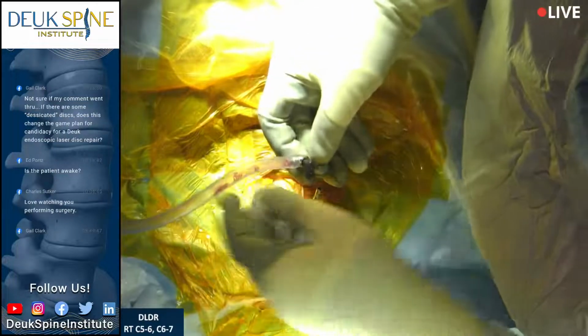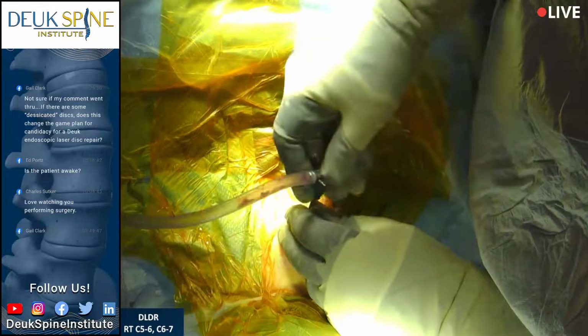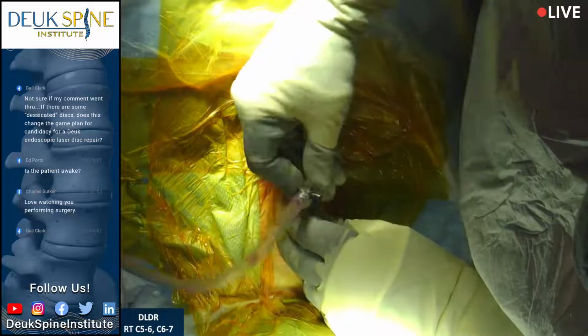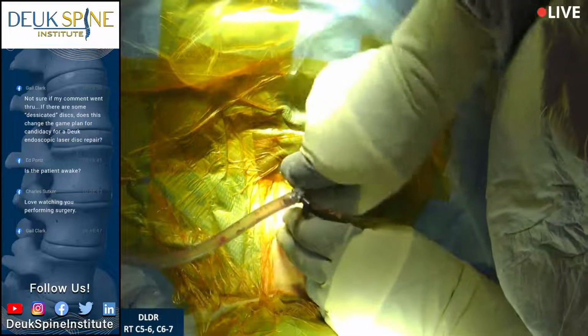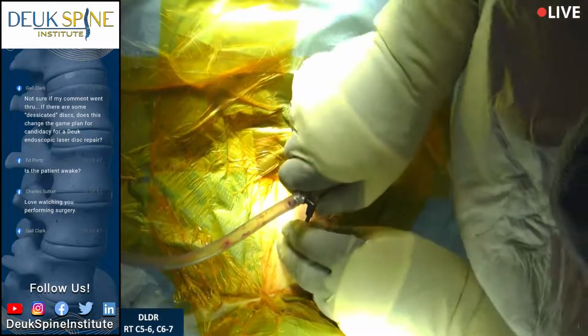But you have to get more of these tubes, Luis. How many do we have? Yes, sir. We have at least 6 right now. We need more. The more degenerative discs we keep dealing with, the more of these situations we're going to encounter. I need you to order more.